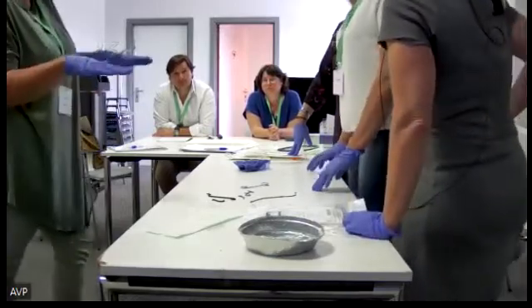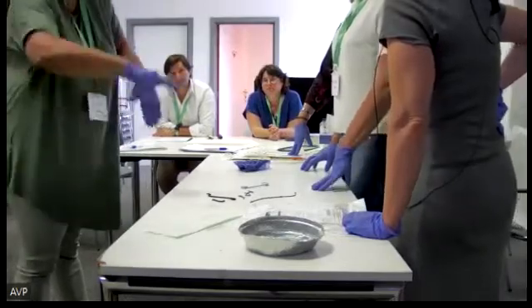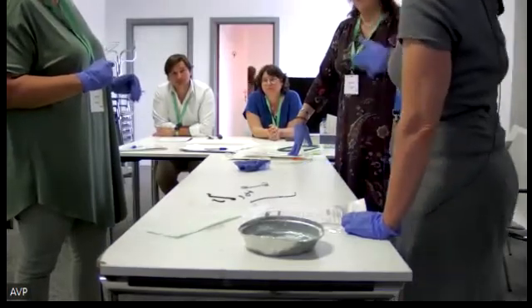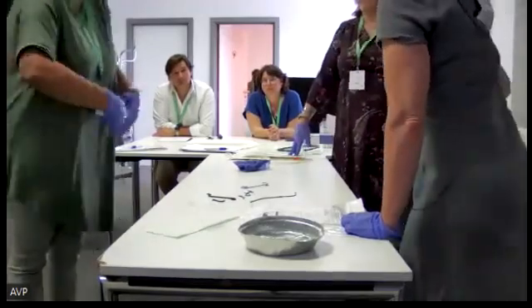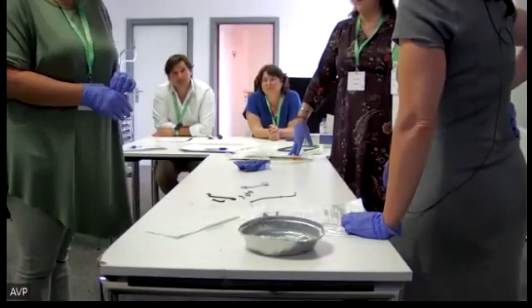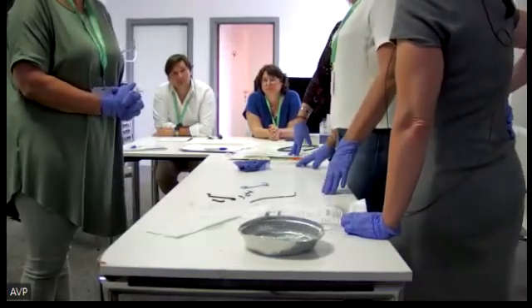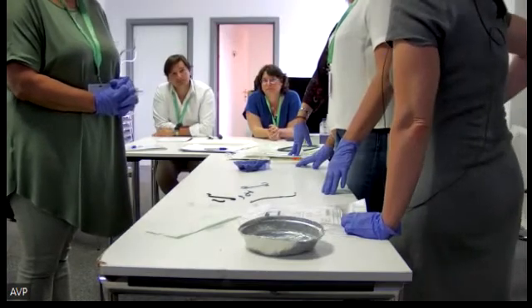And are the patients for the ERCP lying on their tummy or on their side? It's on the back. We have general anesthesia, intubated, on the back, and sometimes we put them on the side. Yes, but in the Netherlands it's prone, on the tummy. Also, we have anesthesia, but without intubation, with propofol. Our anesthesiologists prefer to intubate supine, and we can also turn them on the right.